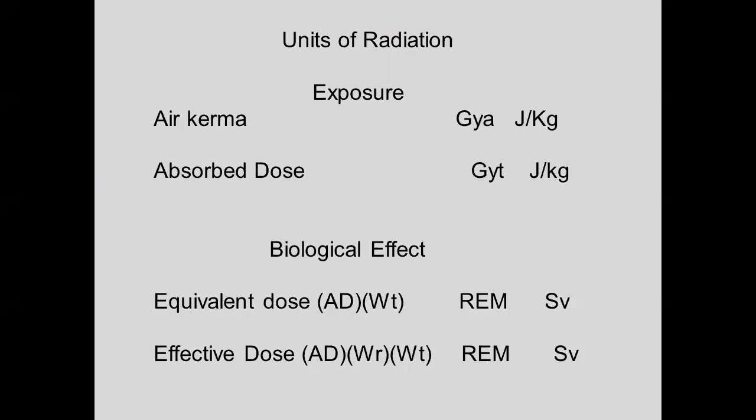Patients don't like us sticking probes in them, so it's easier for us to measure how much radiation is in the air right next to them, and then through studies with phantoms, estimate their absorbed dose, okay? Now, there are some mechanisms. You can put some film, and we can put some detectors now on patients that show kind of real-time doses, but for the most part, if you know how much radiation the machine's putting out, you can mathematically estimate how much absorbed dose they're going to have, okay?